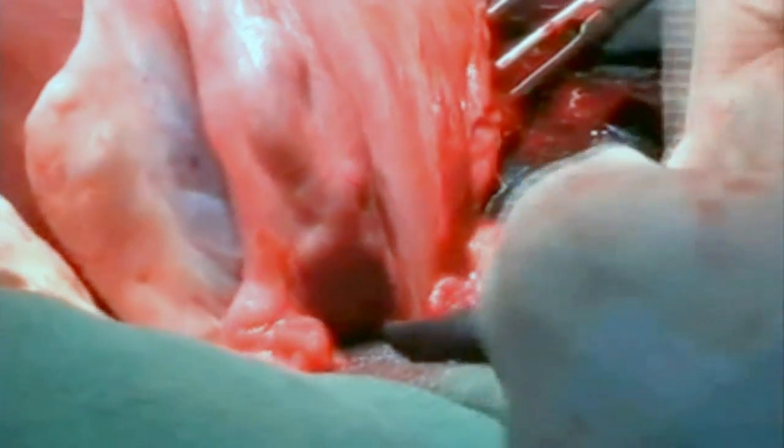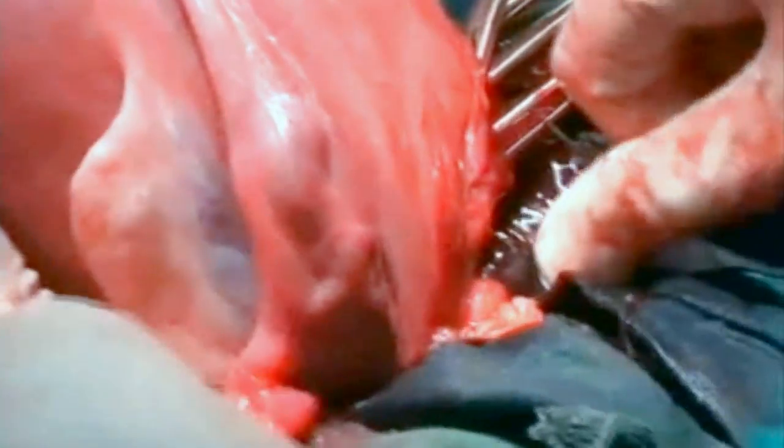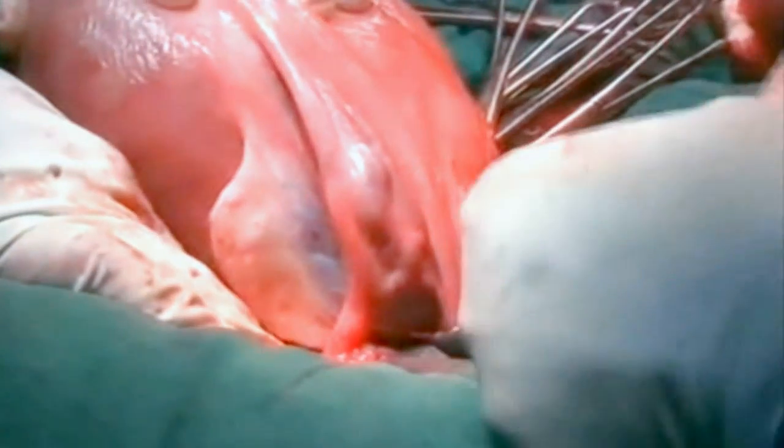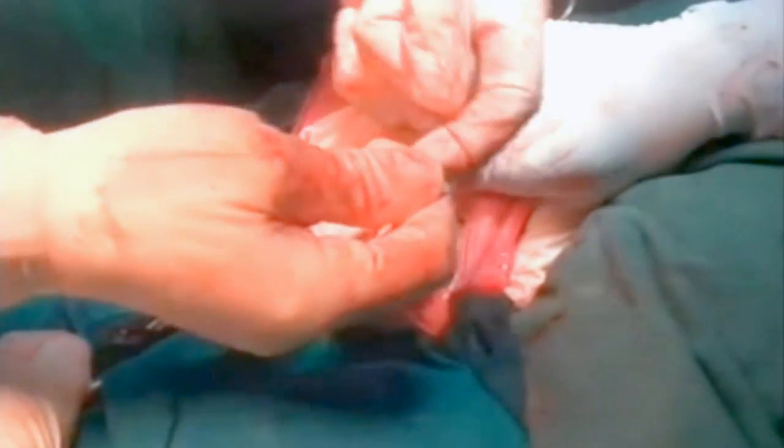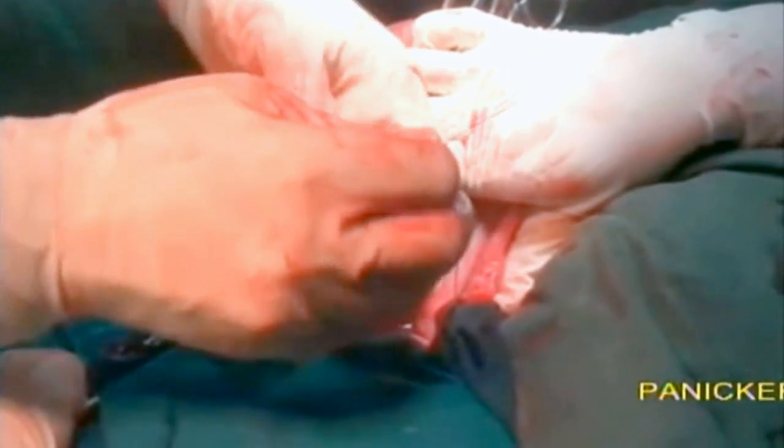This will occlude all the blood vessels including the uterine artery and its branches and the ovarian vessels. You can see the round ligament, infundibulopelvic ligament, the ovary, and the tube. The same procedure is repeated on the opposite side like this.